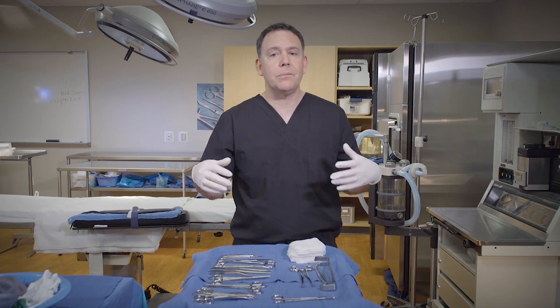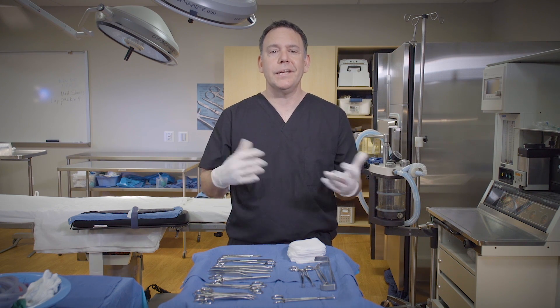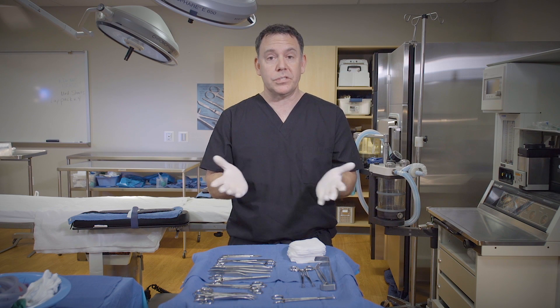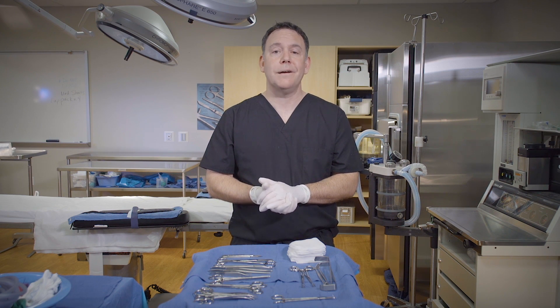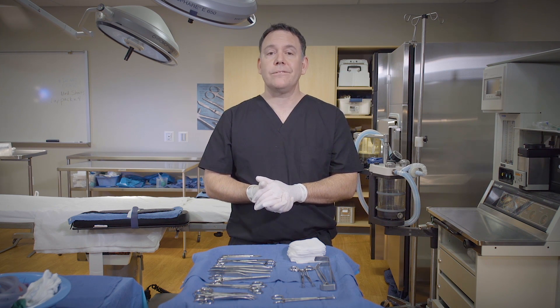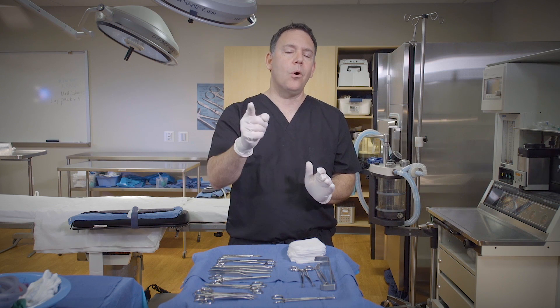You don't have to tell them to point it at the surgeon's heart — you can pick any anatomy you want to — but that visual seems to work for my students. And well, that's it: passing of the basic instruments with and without hand signals. This is Mike from Surge Tech Academy, wishing you a great day in surgery and reminding you to be a superstar in your OR.